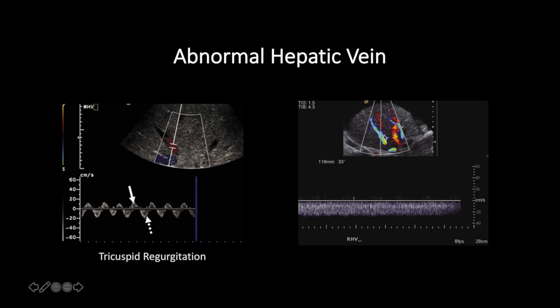And the second case here, so we have clearly a very small liver that looks coarse, abnormal with ascites around it, and then you have a hepatic vein with complete loss or decreased pulsatility. And so this is a case of cirrhosis, of course. This is something you might see in cirrhosis. And so usually you know the patient has cirrhosis, and then you happen to see this waveform as well. It's rare you're going to make that diagnosis alone based on that, at least in my experience. Okay, and so that's it for the liver and for the hepatic vein.